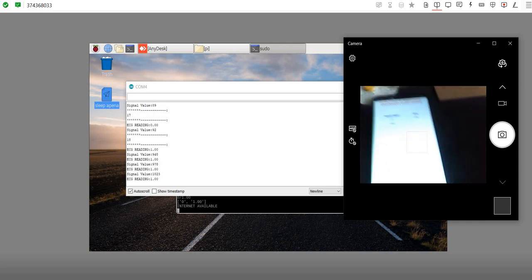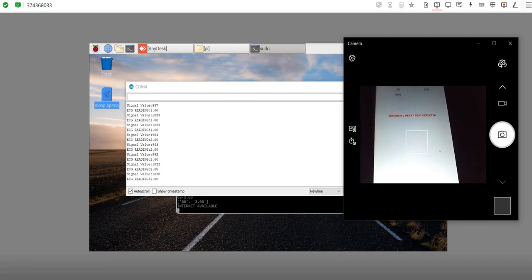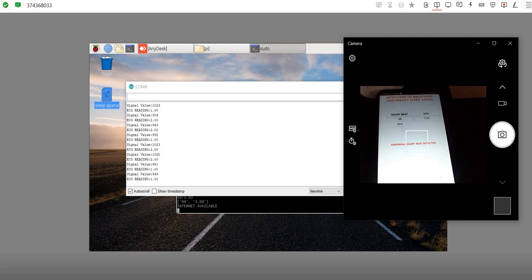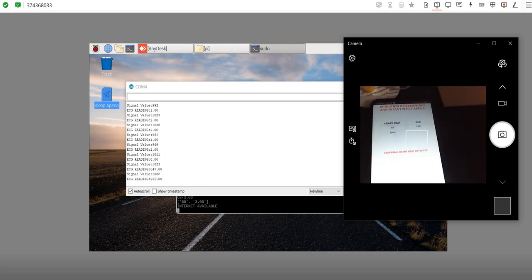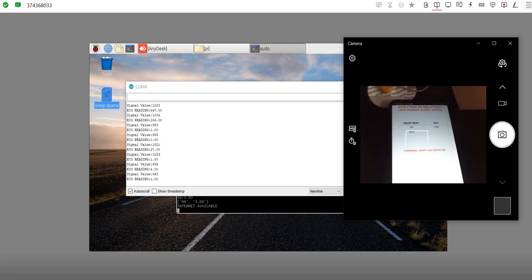Okay, so now you can see it keeps on calculating every 30 seconds. Then we multiply the value we get and give the pulse count, because we can't wait for approximately 1 minute or 1.5 minutes to show. So you can see if the value is less than 70, then we get the alert. In this way you have to run the application, and mostly I will make it auto start, so no need of doing all these things.